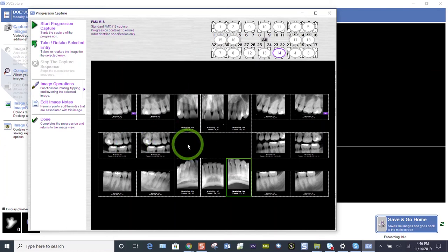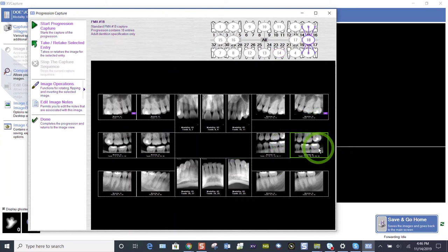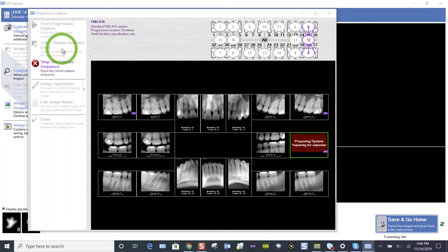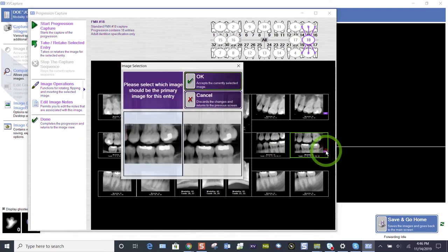I've got a bite wing that's cone cut. So let's choose the left molar bite wing to retake it. Let's just highlight whatever image needs to be retaken and choose the take retake. That way it won't progress to the next tile. It's only going to take that one image. Start. The sensor is going to be ready. We're going to take the image and now I've got that number two there.